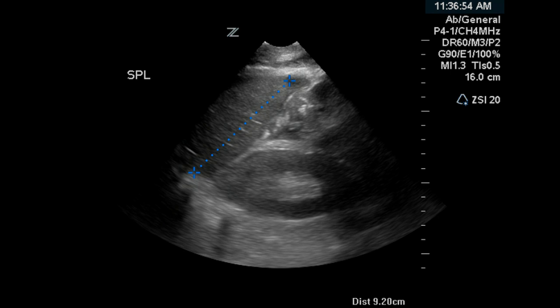The spleen has been measured in this patient and is 9.2 cm, which is a normal measurement for the spleen. It may be perhaps foreshortened a little bit, but still would be in the normal range.